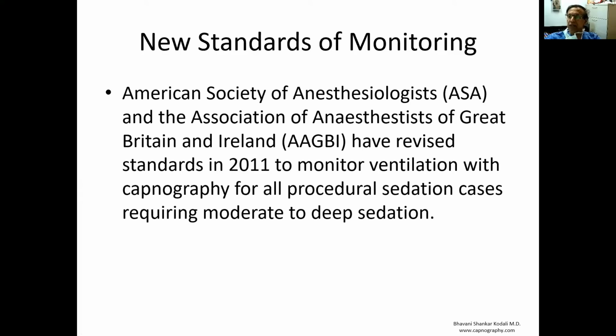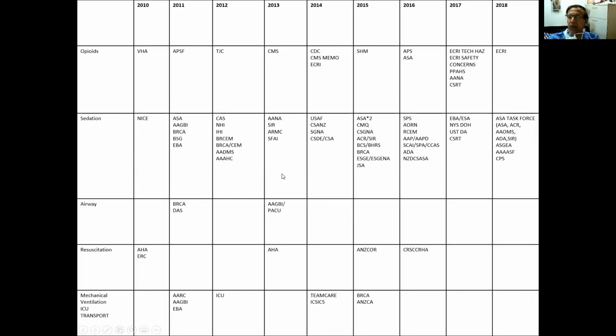The American Society of Anesthesiologists and the Association of Anaesthetists of Great Britain and Ireland introduced capnography to monitor the patient during sedation in 2011. Since then, many associations across the world have introduced capnography to monitor the patient's ventilation during sedation.